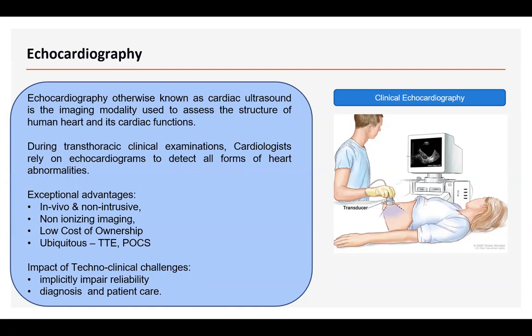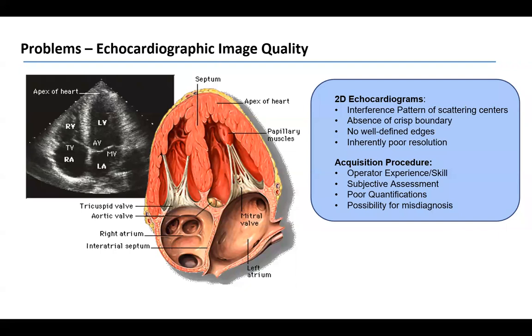Nevertheless, it poses techno-clinical challenges. These challenges implicitly impair reliability and diagnostic outcomes. The problem with echocardiography, however, is the image quality. The way the images are produced through interference patterns of scattering centers inherently has poor resolution. The images are not well defined.